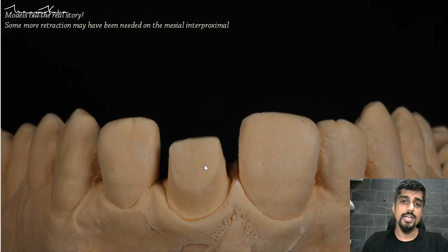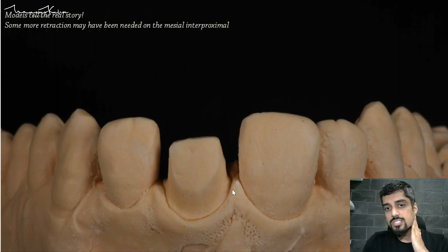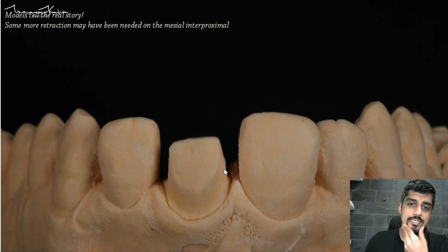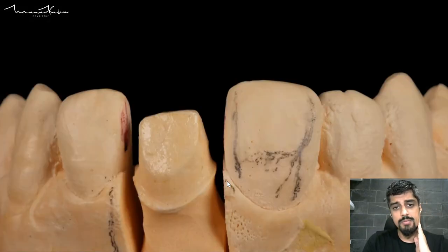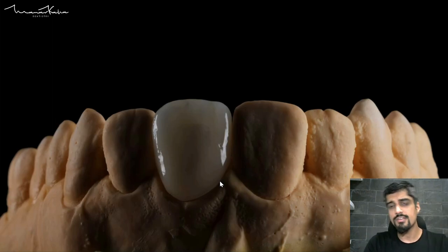What else you can notice is that in some areas the retraction is very good and the gingiva is away from the margin, but in this area my technician is going to find it a little difficult to do the die ditching and die cutting, because the gingiva is too close to the edge of the margin. I could have gotten more retraction, at least in the mesial interproximal region. You learn from your mistakes. This is the die preparation that my technician has done — obviously still a fantastic job — and this is the photograph of the die on which the wax-up and restoration will be made.